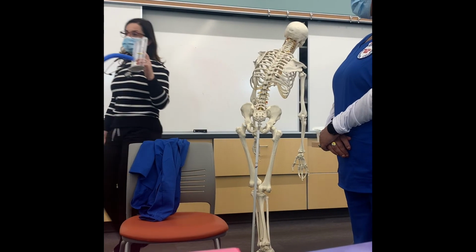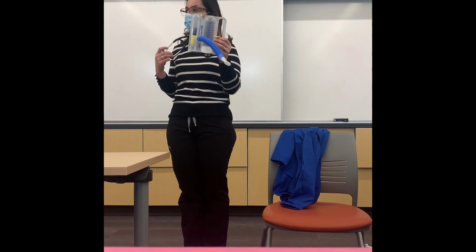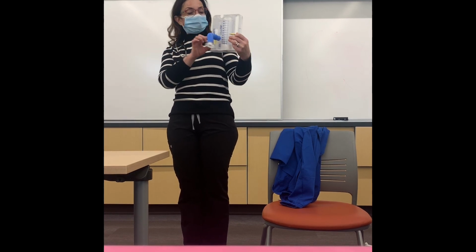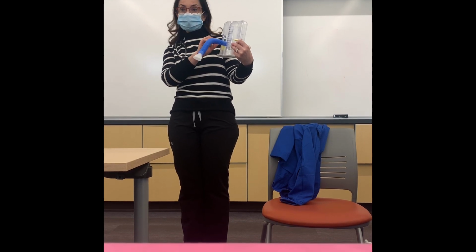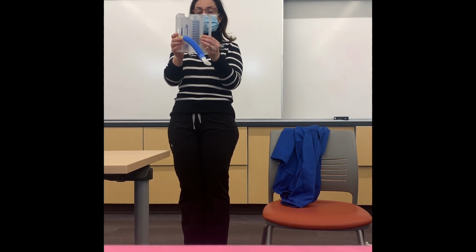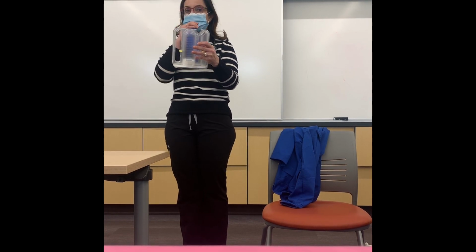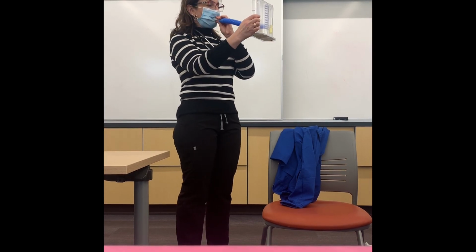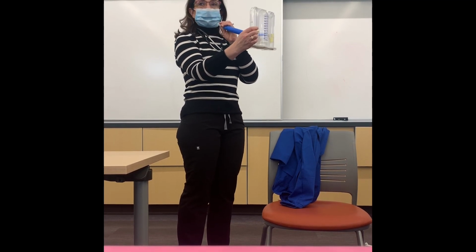I have mouthpieces for it, so you guys can practice with new mouthpieces. But basically the goal, it's not as easy as it looks, I'll tell you that. The little bubble needs to be kept up here. So it can go up and down and it needs to be steady. And then you set the goals for your patient, lower in the beginning. You think you have to blow in it, but it's actually not. You breathe in.